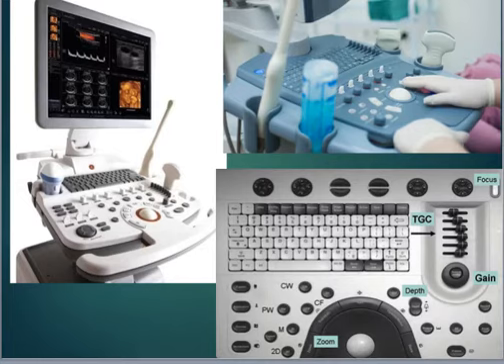These up here, the TGC, are the time gain control. These account for tissue attenuation, and it reduces the impact of the attenuation. So what you can actually do with these is, again, change the brightness and darkness on an image, and it controls it from the top to the bottom of the screen when you're looking at it. So if the bottom's really dark, you can lighten it up. If the top's too light, you can darken it up. So you can adjust your image brightness and darkness here on varying levels, not just the image as a whole. You can change all of it individually.